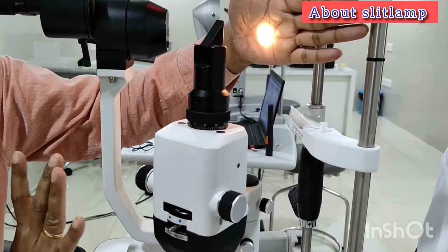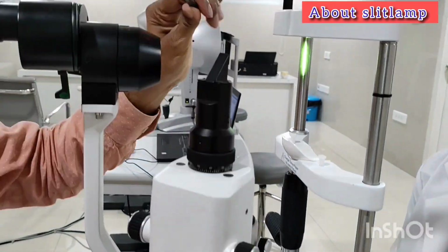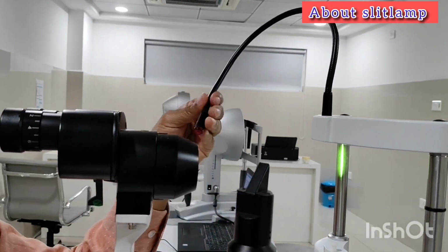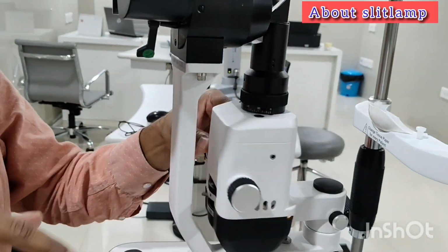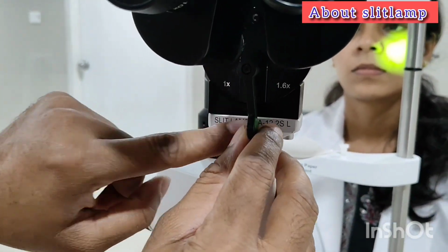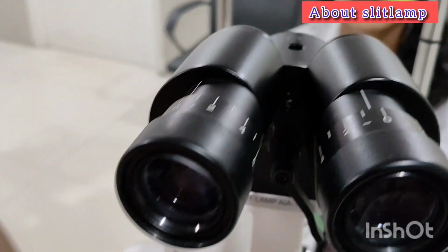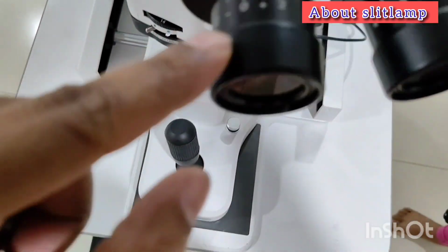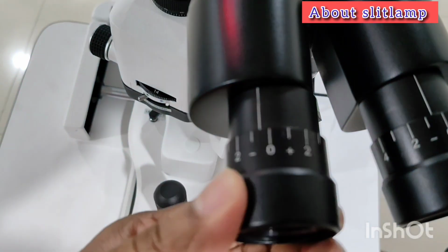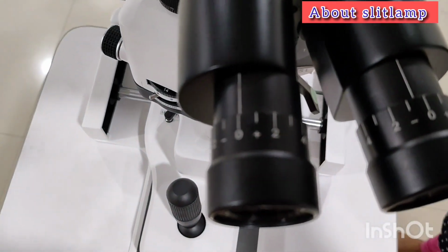We have 3 filters: yellow, blue and green. There is one target LED red light. There are 2 eyepieces with magnification of 10x and 14x. Both eyepieces should be aligned at 0 for an emmetropic examiner, and myopic and hypermetropic examiners can adjust according to their refractive power.